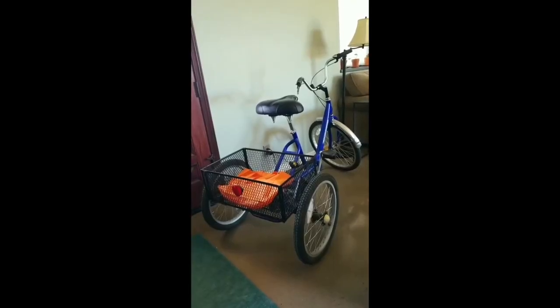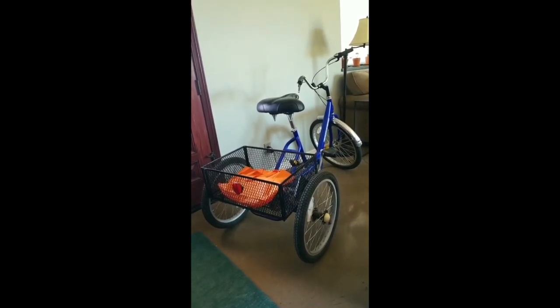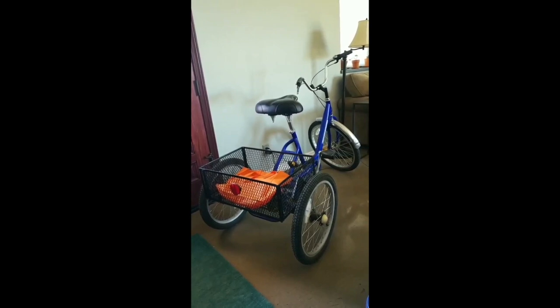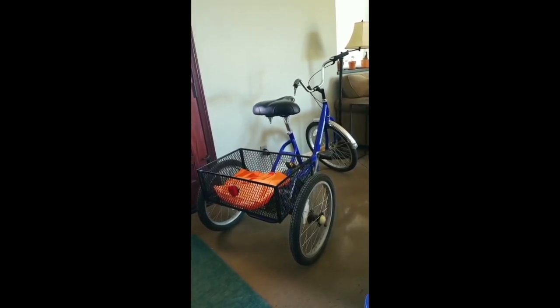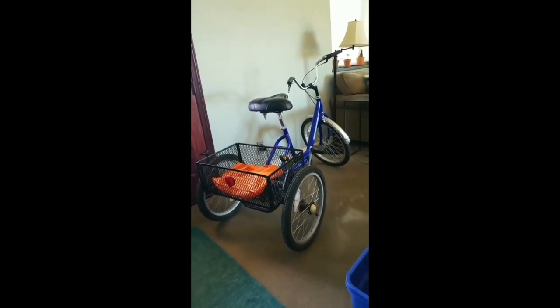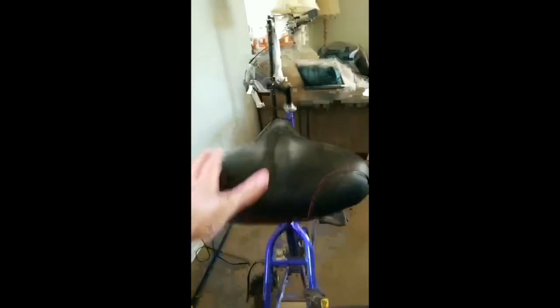And lastly is my form of cardio. So as an amputee, you exert 10 times more energy than a regular person walking. So it can be extremely tiring very quickly, and so this is a great alternative to doing cardio as opposed to taking a walk. It has a strap for my foot, otherwise the prosthetic side would not stay on, and so that's super helpful.